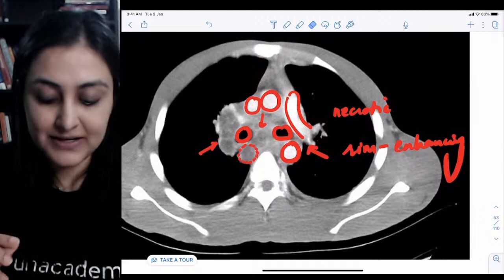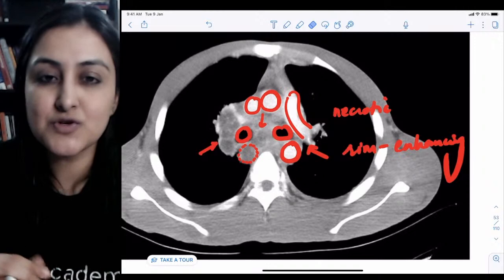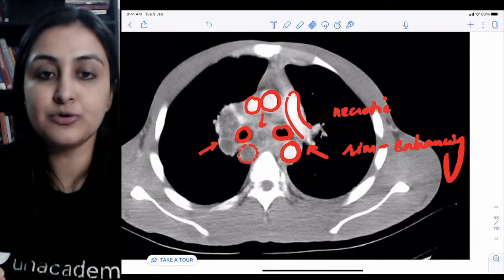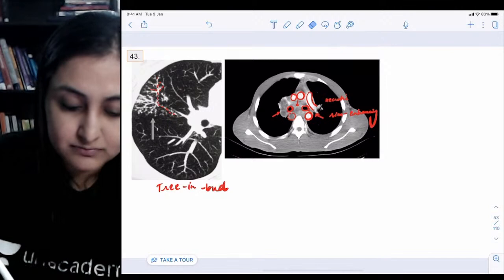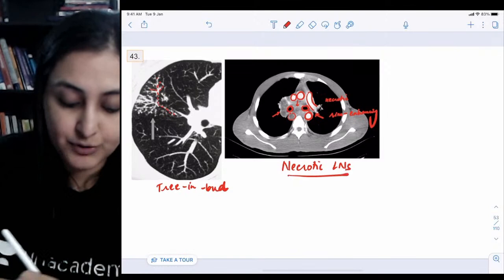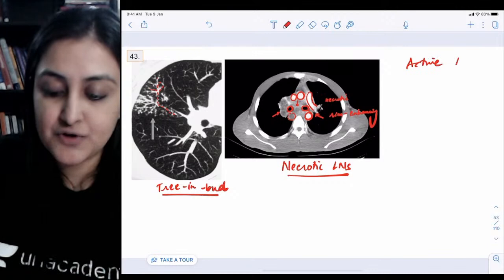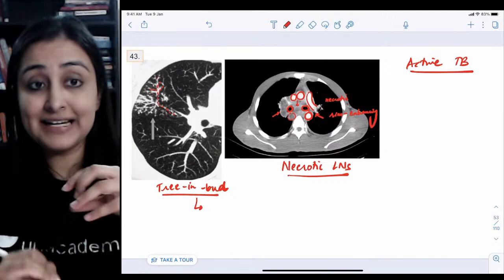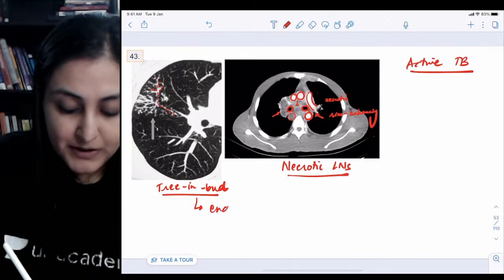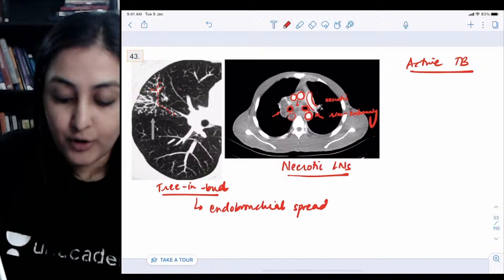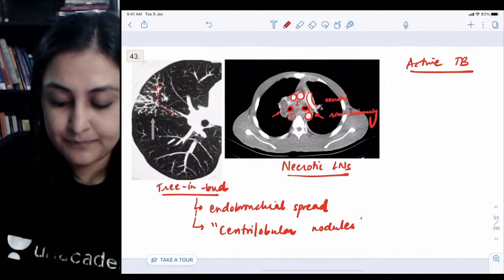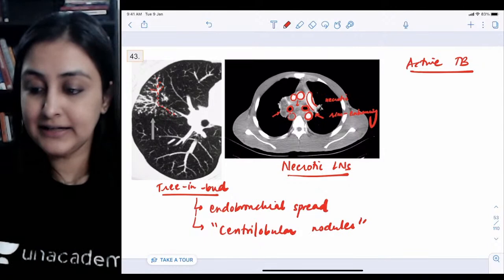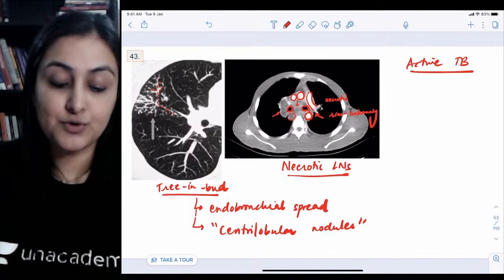Remember: conglomerating, necrotic, rim-enhancing lesions are TB's hallmark anywhere in the body. The esophagus, being a collapsible tube, is compressed among these enlarged lymph nodes. To summarize: the two main CT findings of active TB are necrotic mediastinal lymph nodes and tree-in-bud sign. Tree-in-bud indicates endobronchial spread of TB, and this pattern is also called a centrilobular pattern — centrilobular nodules — all pointing to active tuberculosis.